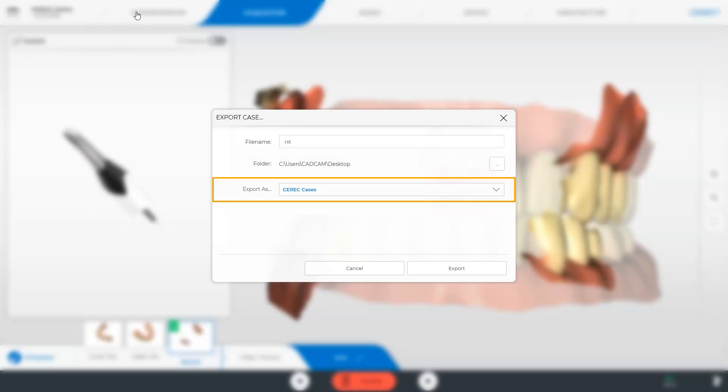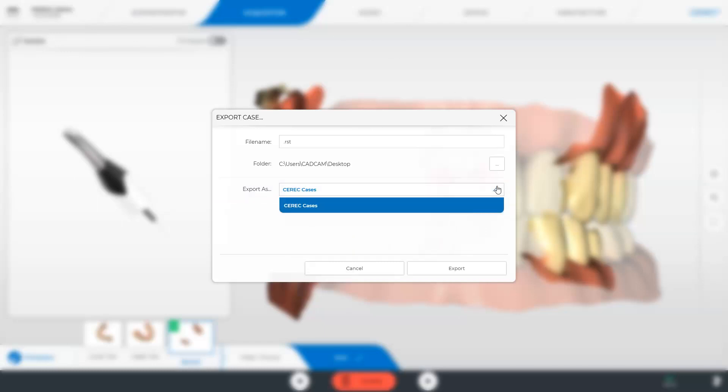Then you can export a CEREC case in the RST file format. This format includes only the scan data and no model data since the models are not correlated until we switch to the model phase. An RST file can be exported to any other CEREC software of the same software version or higher. By clicking export the process is initiated.